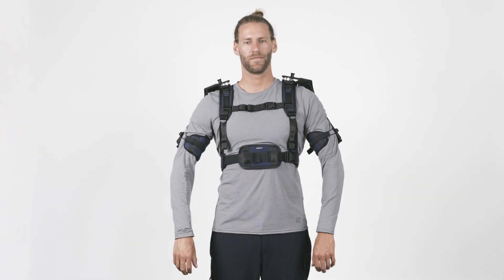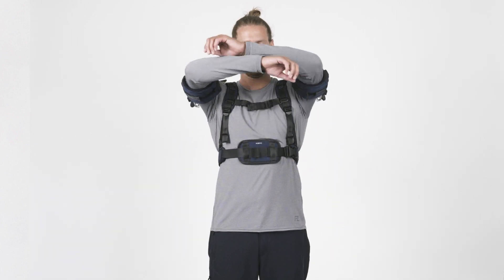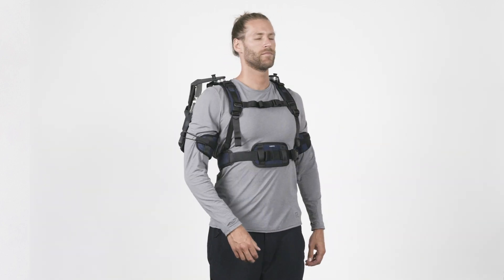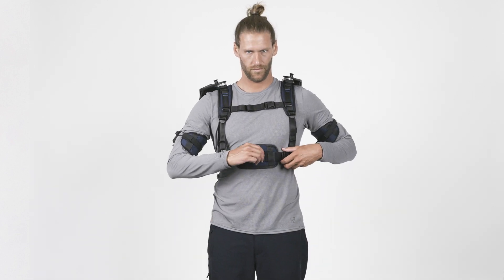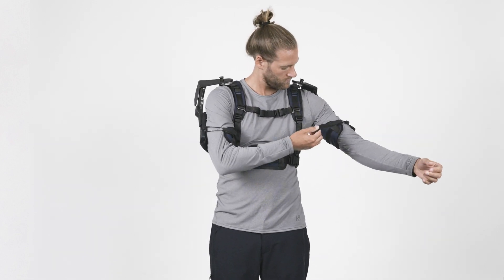Once you wear the DeltaSuit, it is time to test the exoskeleton and adjust it for optimal fit and comfort. Move your arms around, rotate your upper body, inhale deeply, and see if the suit is well connected to your upper body and arms but still comfortable to wear. Readjust the fitting if necessary by further tightening or loosening the straps.